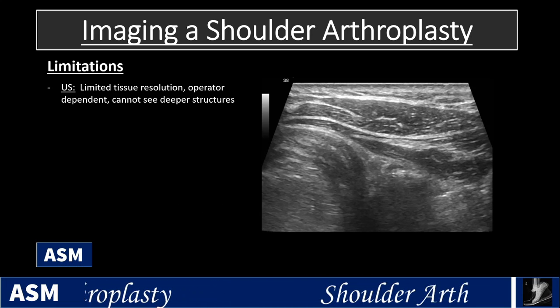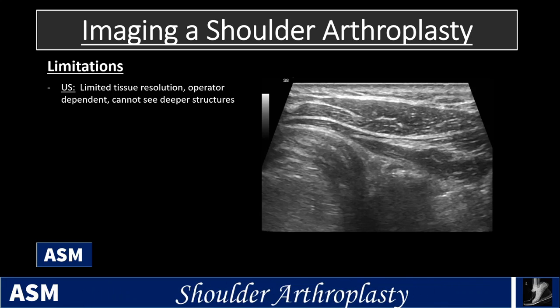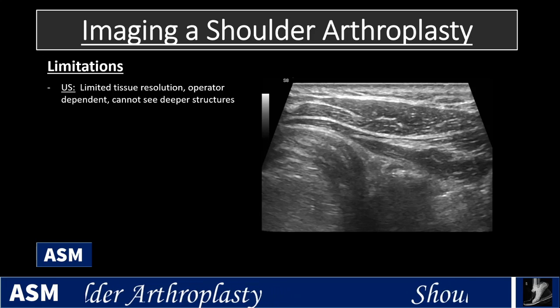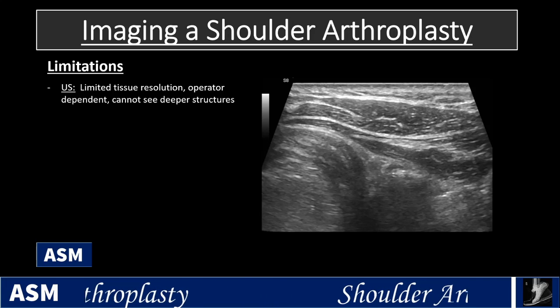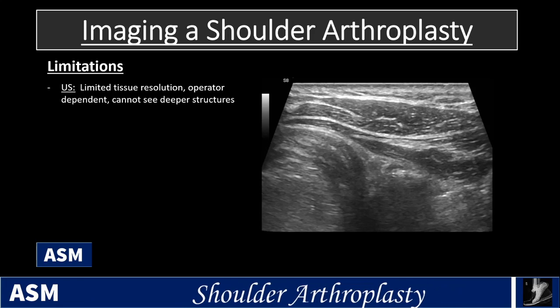And I gave just an example image of ultrasound, limited by tissue contrast and penetration, so you end up losing spatial resolution as you have to drop your frequency on your transducer. So deeper structures are harder to characterize, and it's operator dependent.